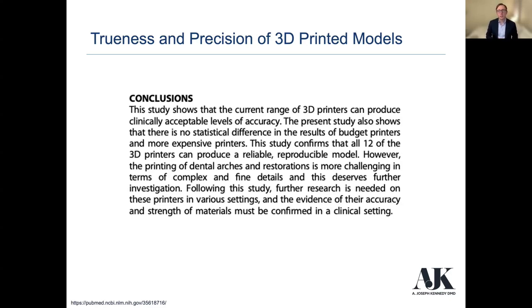Printing of dental arches and restorations is more challenging in terms of complex and fine details, and it deserves further investigation. So again, there are a lot of different types of 3D printers out there for things like model making. You could probably get away with some of the budget ones and be just fine.